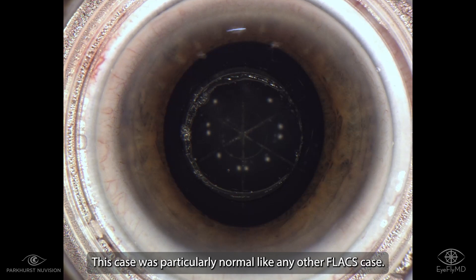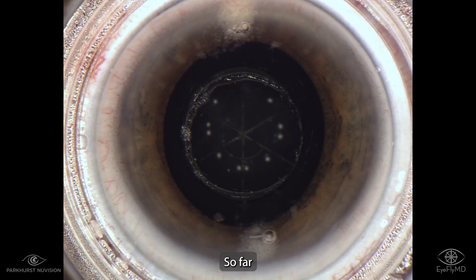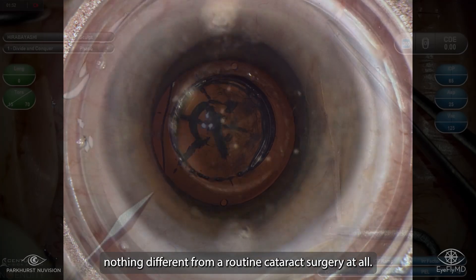So this case was particularly normal, like any other FLACS case, and there we make the arcuate incisions. So far, nothing different from a routine cataract surgery at all.